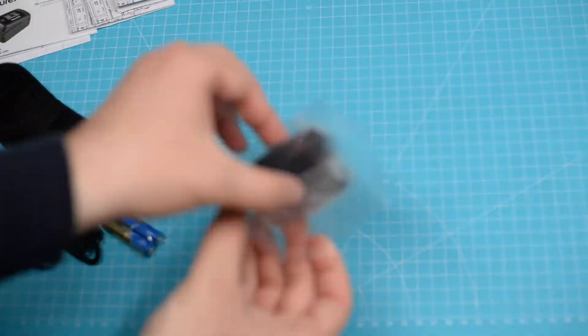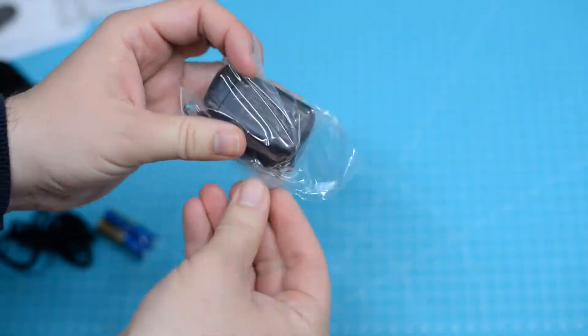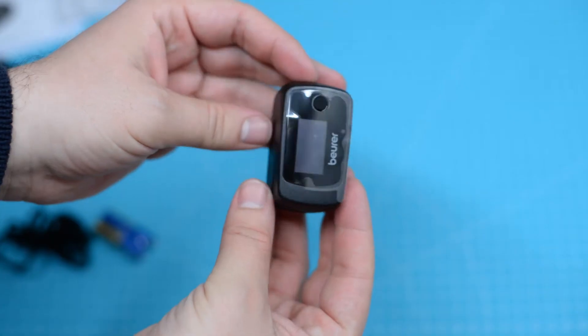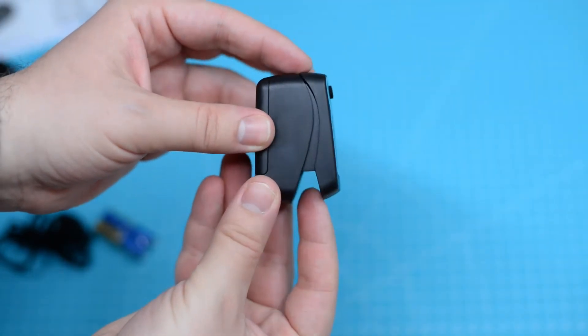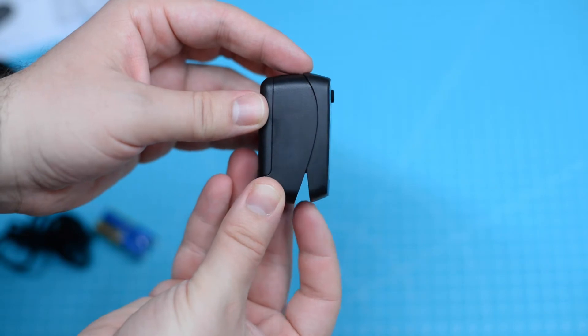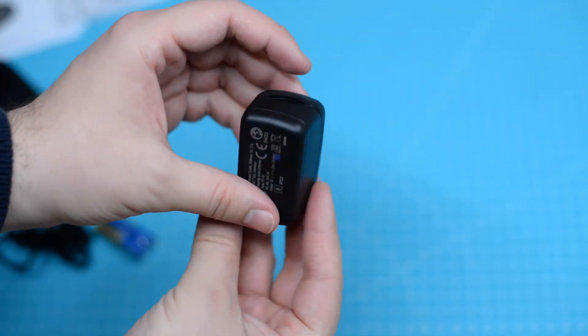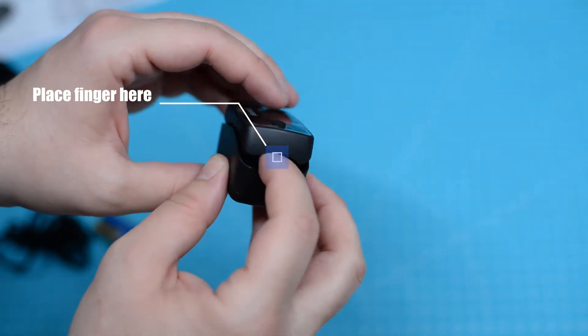Here's the pulse oximeter. The pulse oximeter is a device that estimates the amount of oxygen in your blood. It does so with the use of infrared light that is sent into the capillaries of your finger. The infrared is bounced back by the oxygen in your blood, and that's the measurement.